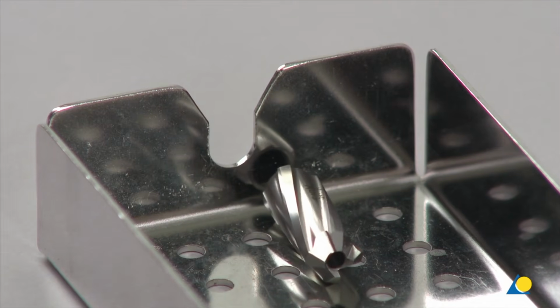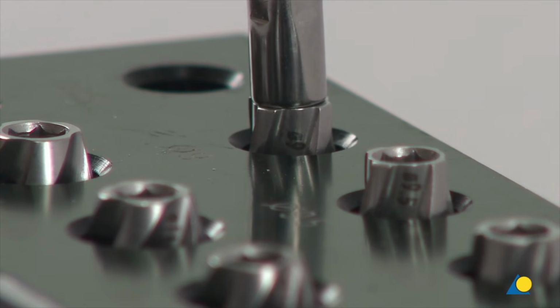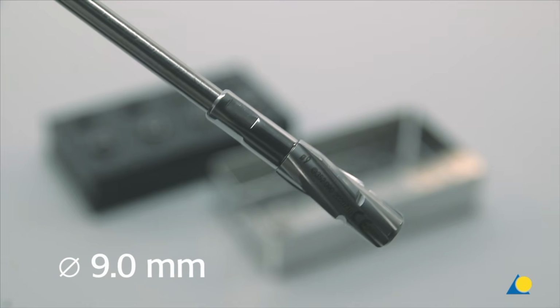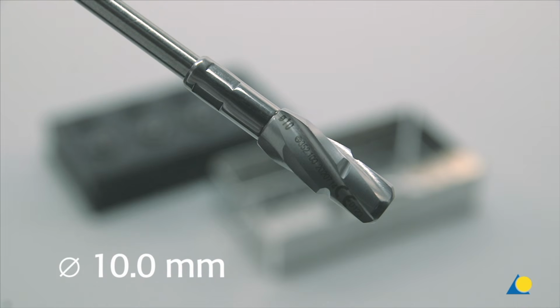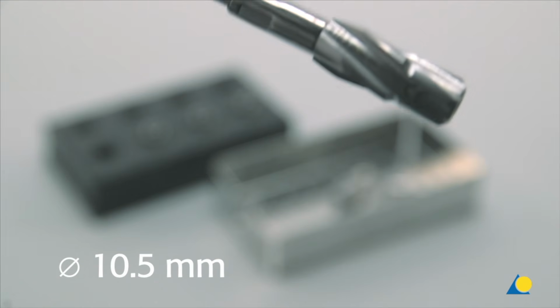The reaming procedure is continued, reaming in 0.5 mm increments up to a diameter of 0.5 to 1.5 mm greater than the nail diameter. Starting with the 9 mm reamer head, it can be seen that the larger-sized reamer heads do not have a cutting tip. As the nail diameter is 9.0 mm, we will ream to a diameter of 10.5 mm.